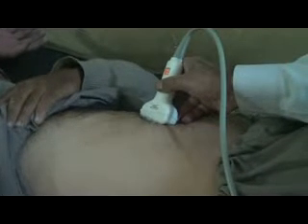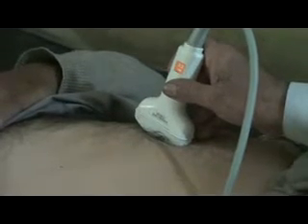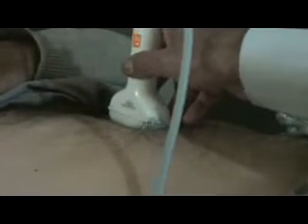If there is any issue, then you can ask the patient to take a deep breath and hold it. In this view, you will be able to see the neck, and especially the fundus of the gallbladder, which is very important to be seen. The reason being, at times stones are present at the fundal region. So let's study this maneuver: patient in left lateral decubitus posture, placing the probe in line with the subcostal region, and then moving the probe where you can get an impression of the gallbladder, and then angling the probe in this direction.